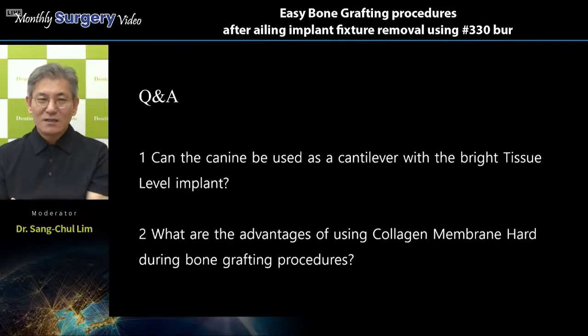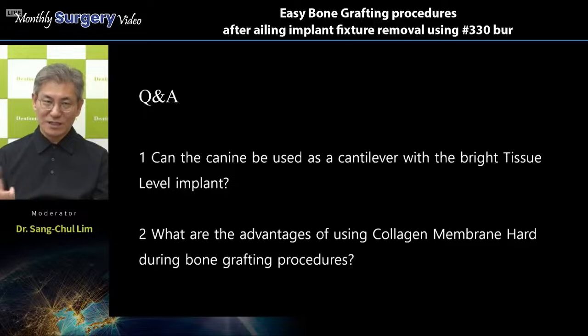So after inserting this bright TL, the implant fixture installation at this 32 area, and then removing the failing implant, right? That is one of the reasons for making the procedure this way.